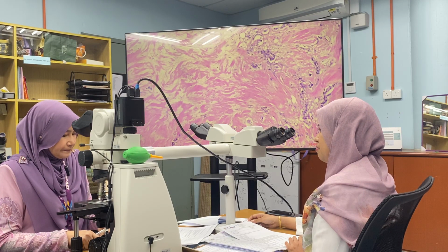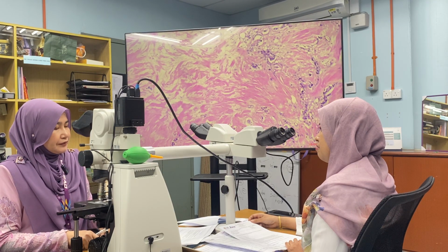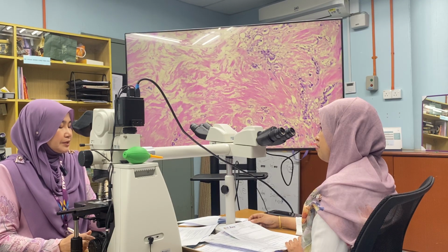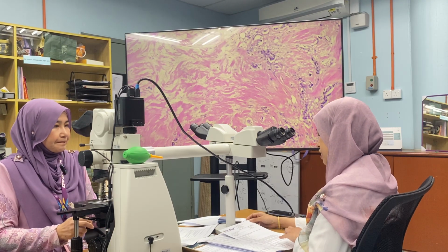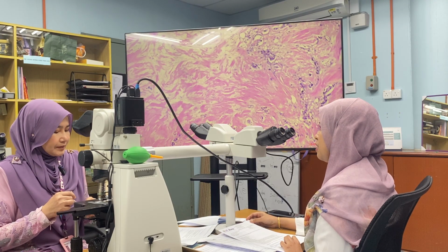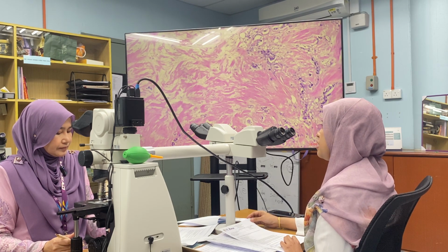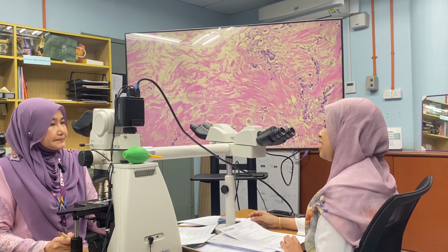What is actually the pathologist's role in the evaluation of the response to neoadjuvant chemotherapy? Our role is to aid the clinician in assessing the pathological response to the chemotherapy, because when we examine and submit the specimen, we can assess the tumor response to the chemo by using the Miller-Payne regression grading.